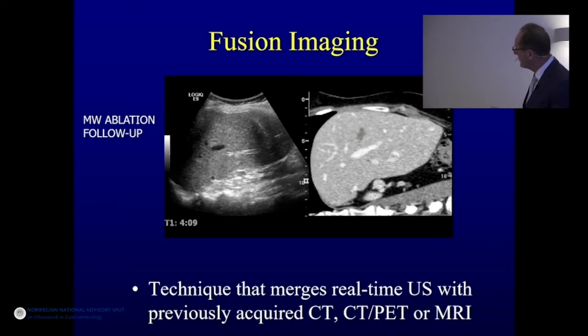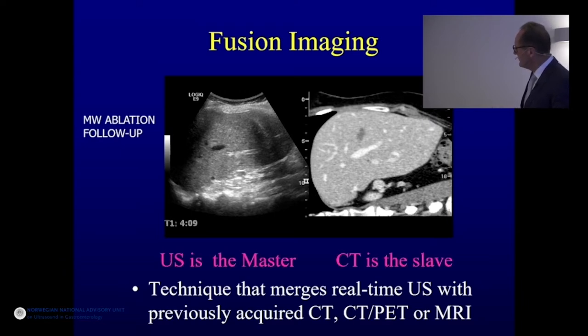Sorry, it's not running. It should run. Anyway, what we have is that ultrasound is the master. You are scanning, and the CT has to follow. So the CT is the slave. So all you see on the ultrasound, you can identify on CT, what that was or what it is.